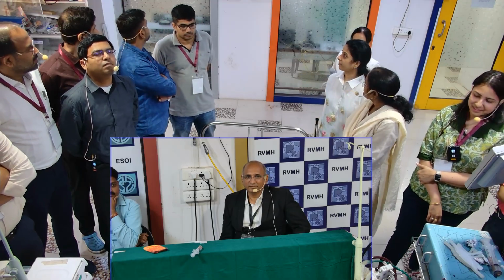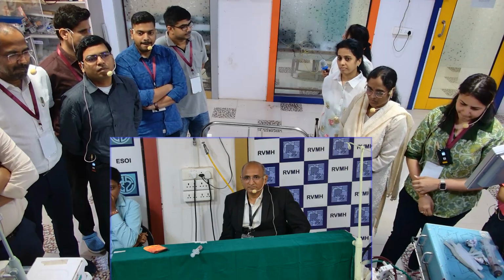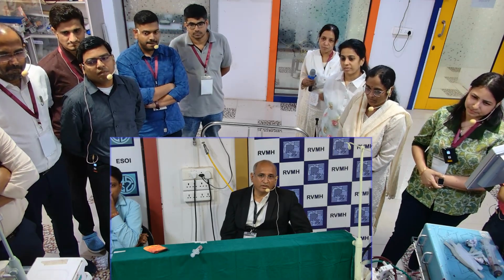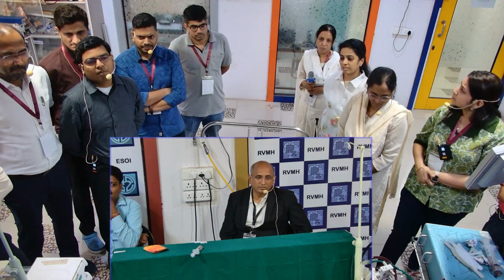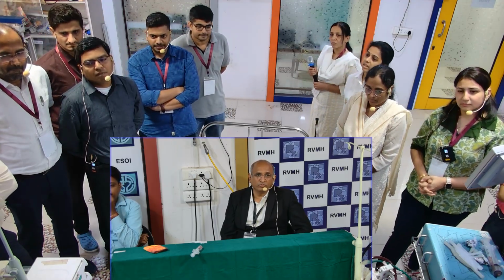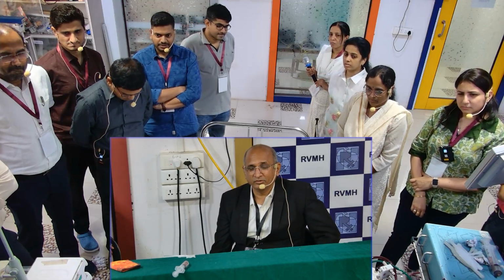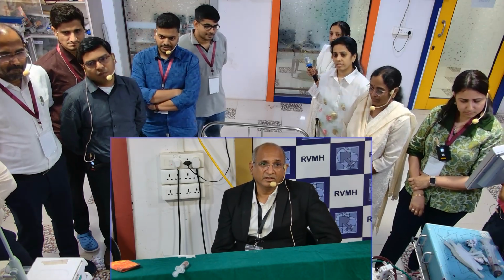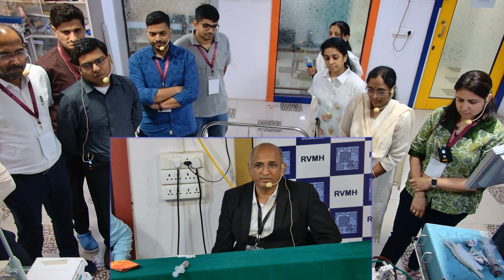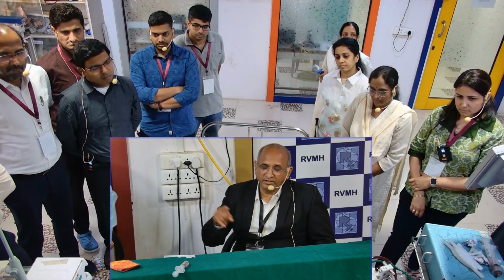Sir, my question is, when we already have this temperature regulator, what is the role of the HME? See, the HME is connected to the sweep gas. In the sweep gas there is always condensation, and that is why membrane edema occurs. So the fluid should not go inside, and that's the reason it has been kept.